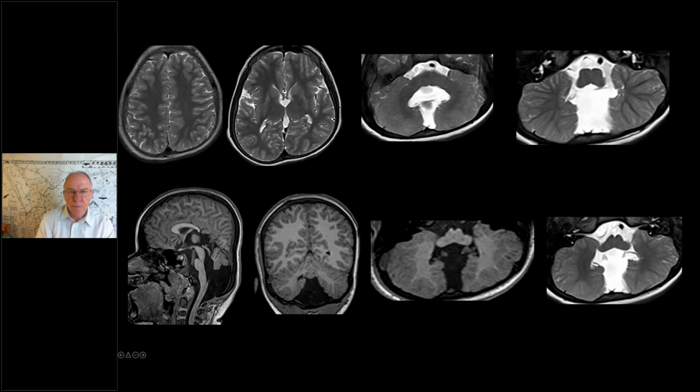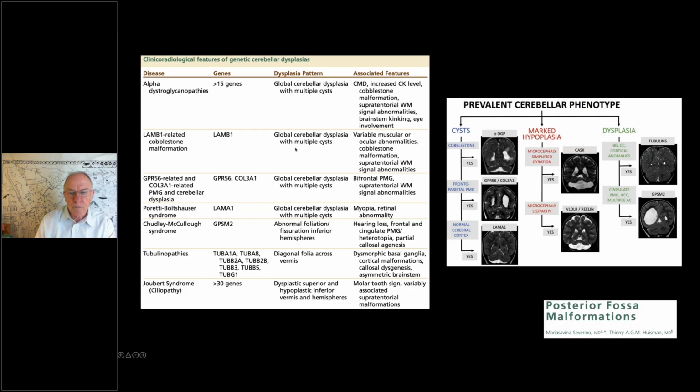So at this stage, the main findings are pontocerebellar hypoplasia with cerebellar dysplasia, tiny microcysts, some degree of volume loss in the basal ganglia on both sides, no cortical malformations, no white matter lesions in the supratentorial brain. So differentials are wide. I could not narrow it down to a particular diagnosis, but these are papers from Johns Hopkins, also Dr. Boltshauser has been part of them.